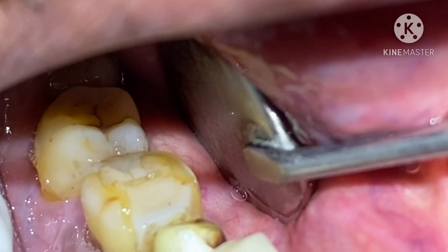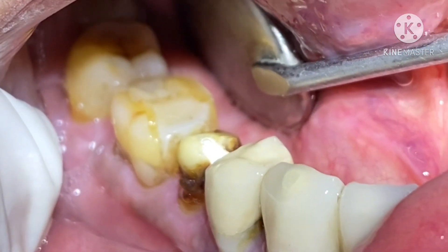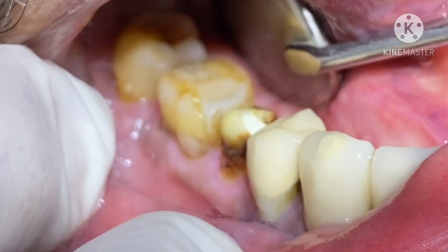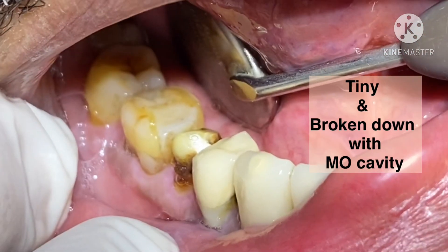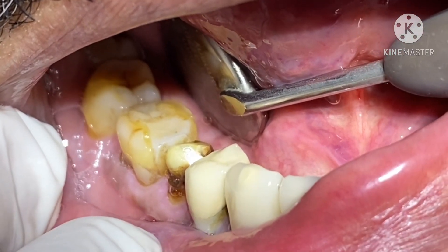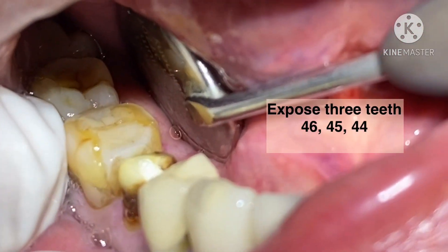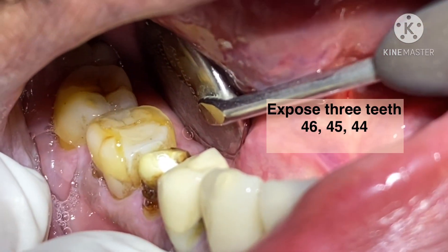The clinical condition is we have an MO cavity on tooth 4-5. In this tooth, the crown has been removed and we have to do root canal treatment. The tooth is so tiny that it is not possible to isolate this tooth only. So what we will do is expose 4-6, 4-5, and 4-4.